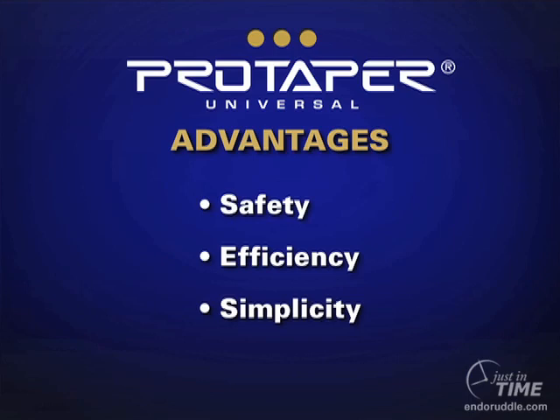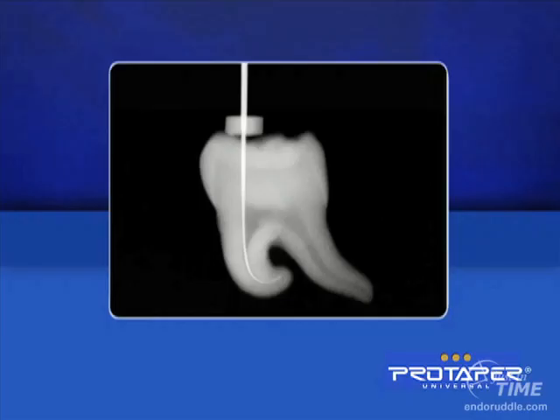So when you throw these three things together, it gives you a wonderful set of mechanical instruments that rotate and carve shapes. In this instance, we have a very dilacerated ex vivo tooth, and you can see we have a 15 file around a significant curvature in the mesial system. Again, the key is to have a smooth, reproducible glide path. When we have a smooth, reproducible glide path, we can consider using a snap-on handle.